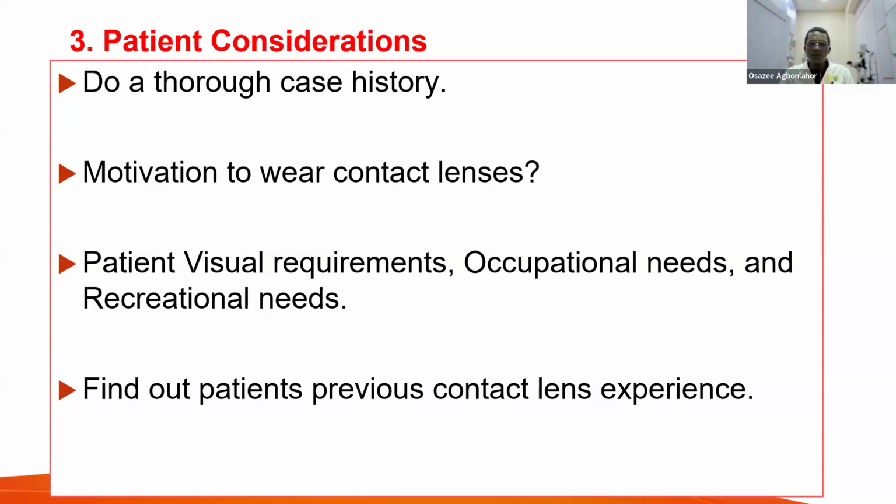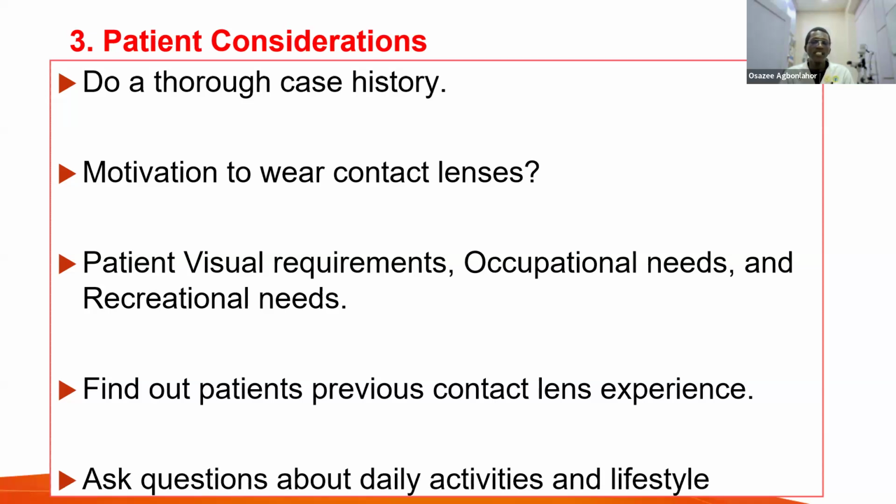Find out the patient's experience about contact lenses. Some of them don't have good experiences. I have a patient, the patient is still with me. We tried her for contact lens before. She's a presbyope. I was fitting her for multifocal, but she had not had an experience before. So I had to try her on single vision first. In fact, I taught her how to wear it. She removed it in front of me in the clinic. So she took it home. I told her, try it at home. She took it home, put it in her eyes, but to bring it out now, wahala.